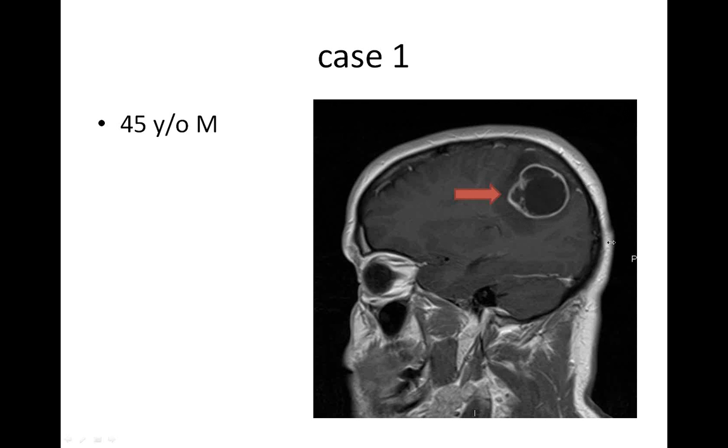Now, you'll see there's white stuff around the edge of the tumor. This is contrast agent that's being taken up by the tissues in that part of the brain. The patient's been given IV contrast dye, and it's accumulating preferentially in certain parts, particularly in the tumor of this patient's brain. The buzzword we would call it is contrast enhancing, or in this particular case, ring enhancing. And that's generally a bad sign. The ring enhancement usually means a high-grade glioma.